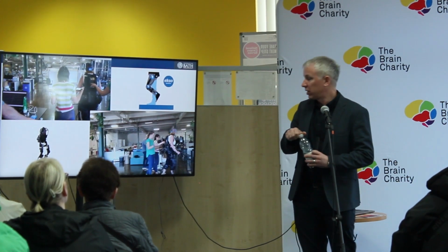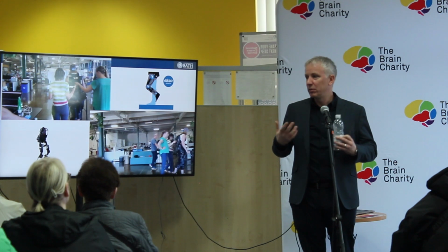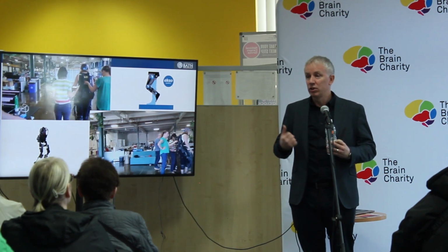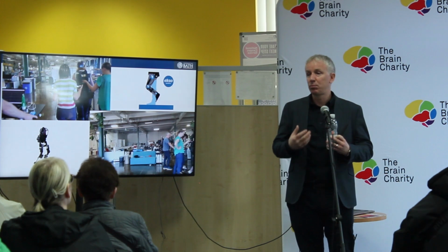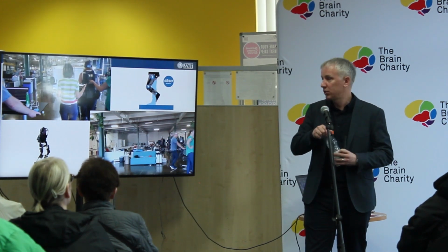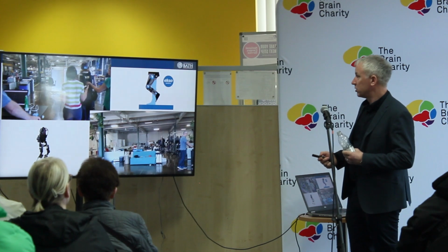So this is very important, because if a physio is there moving your arm, the person could be daydreaming, maybe not engaging in the task, and that's not as effective. Whereas with the brain-computer interface, nothing will happen unless we detect changes in the brain activity first. So your brain is primed then to have the most impact with a stroke rehabilitation technology like that. And we have a lot of evidence to suggest that this is better.